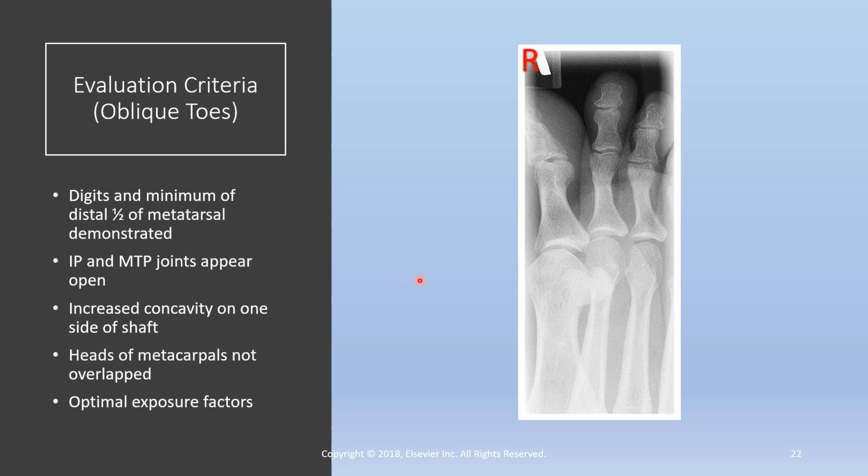Toes aren't the easiest thing because people can spread out their fingers. Toes are a little bit more of a challenge. And you can see this marker is added after the fact because literally this is all that was there. I added that marker because this is not acceptable. You have no idea what that marker would be. I don't even know why they would really put that in there like that.